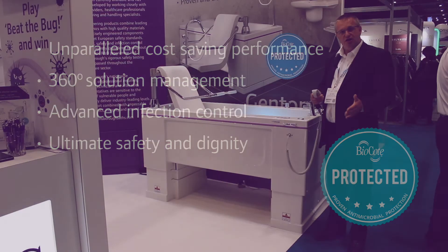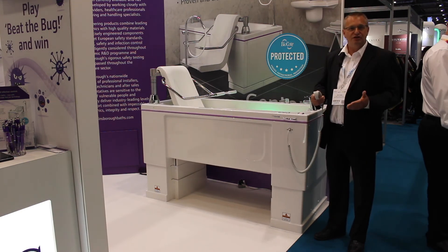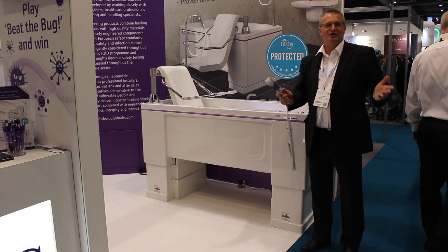Also, as I say, it's a high-low bath, so the bath raises to whatever level the carers are using, which means that carers can stand in a very good posture and not have any muscle or skeletal injuries. So that's the Gentona bath from Gainsborough Specialist Bathing. Thank you very much.